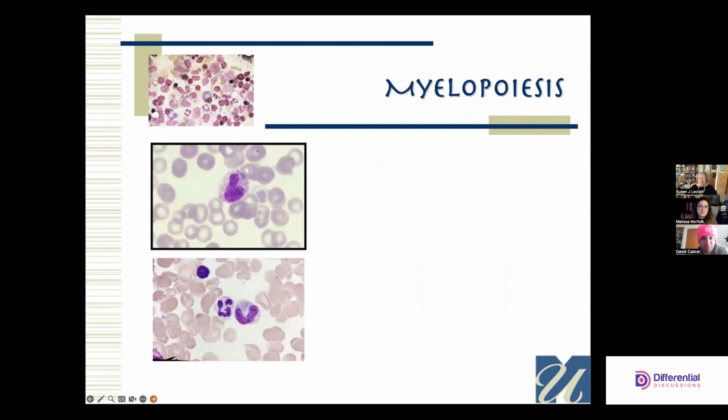Okay, so the most common problem that most people have is, is it a band and is it a poly? And we could spend days and probably carafes worth of wine arguing about the various nomenclatures for this, because we still have them. I am going to stick, so don't tell me whether or not it's segmented, and don't tell me whether or not you think that it's indented more than 50% of blah, blah, blah.